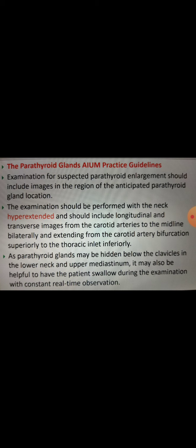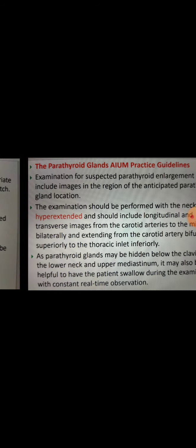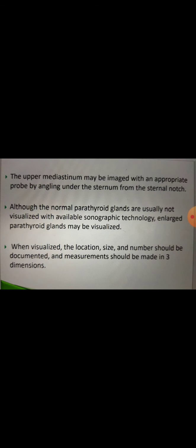As the parathyroid glands may be hidden below the clavicles in the lower neck and upper mediastinum, it may also be helpful to have the patient swallow during the examination with constant real-time observation. And if you are suspecting the parathyroid glands in the upper mediastinum, then you can image it with proper probe angling under the sternum from the sternal notch.